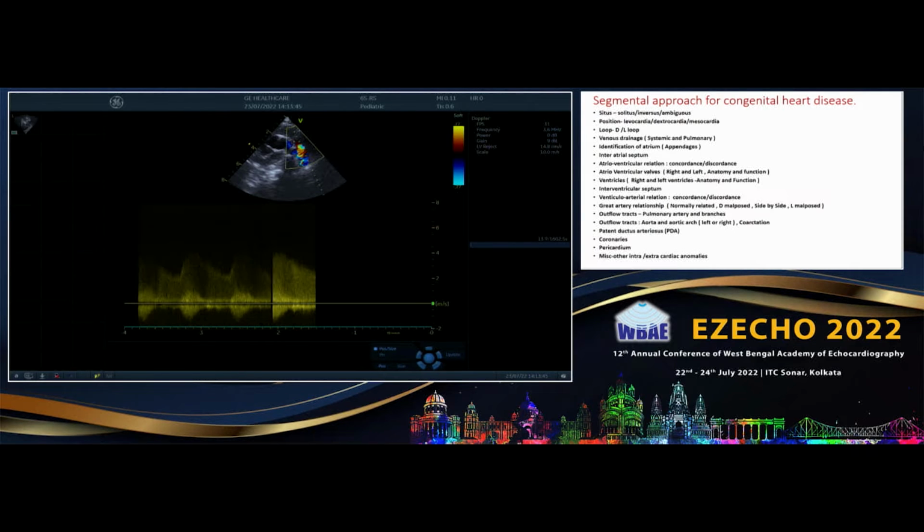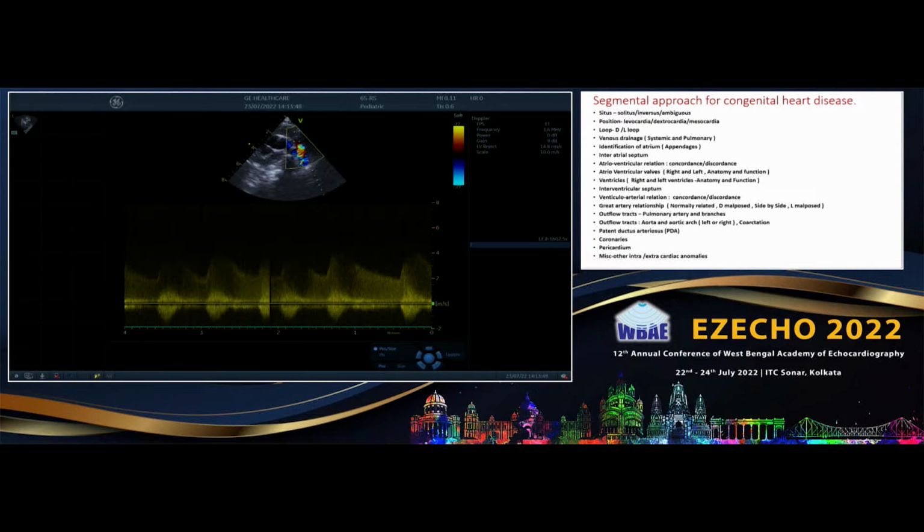That is a good thing, sir, because if we miss, we'll be observing, yes, it is continuously giving you a buzz. So this Doppler flow is very important because you need to see the systolic as well as the diastolic. Because in pulmonary hypertension, it is the diastolic component which decreases first, followed by the systolic, and then the reversal. No, but sound is not getting generated. It's a silent zone.